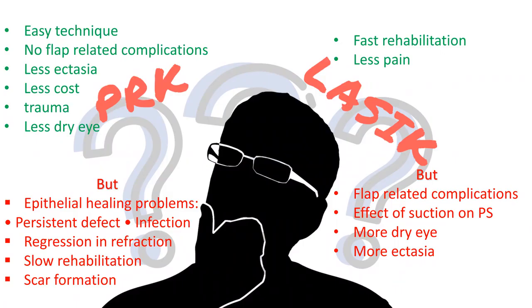For the PRK, first of all, the advantage is that it is an easy technique. The human factor here is very minimal, like the surgeon interference is very minimal, so no need for skills for this procedure. And also it is safer because there are no flap related complications.